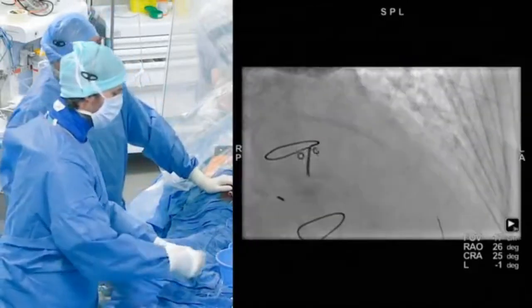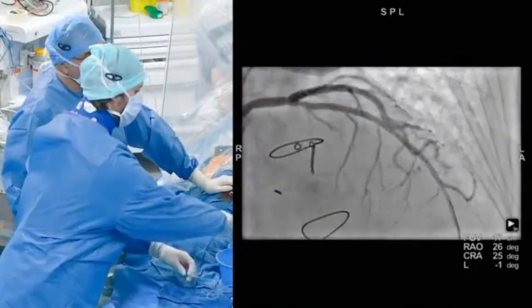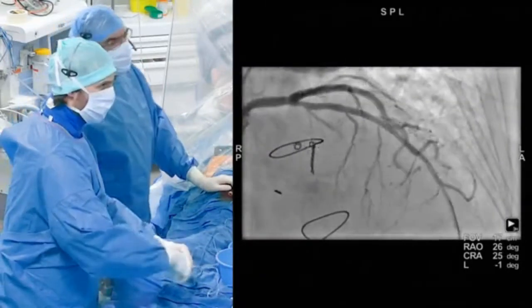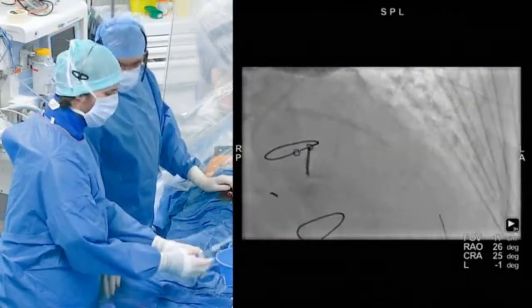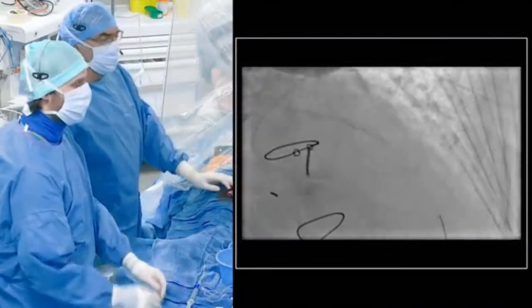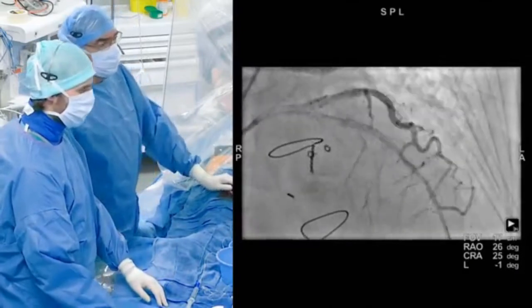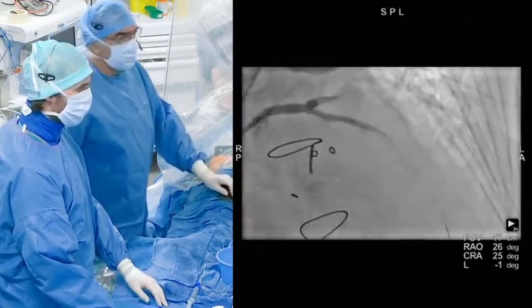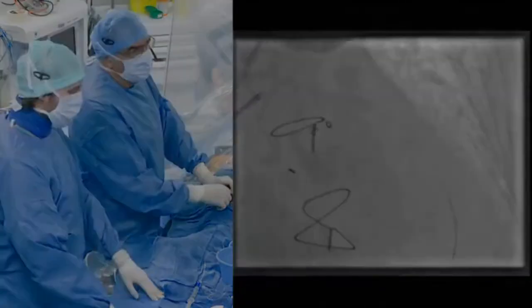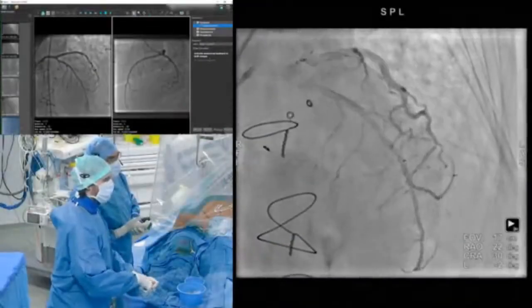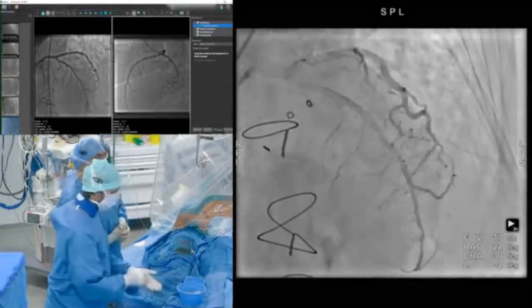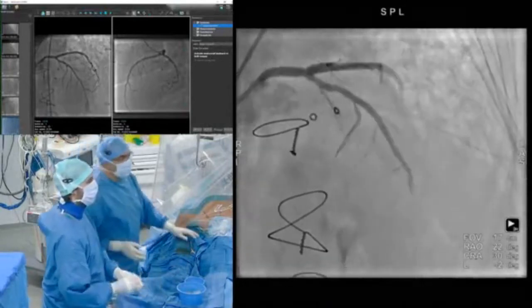The result looks good. The stent looks well opposed, with no dissection on the proximal or distal edge of the stent. The flow is good. What we could do now is to perform the QFR post-PCI. Angiographically it looks good, and we can calculate the QFR post-PCI.